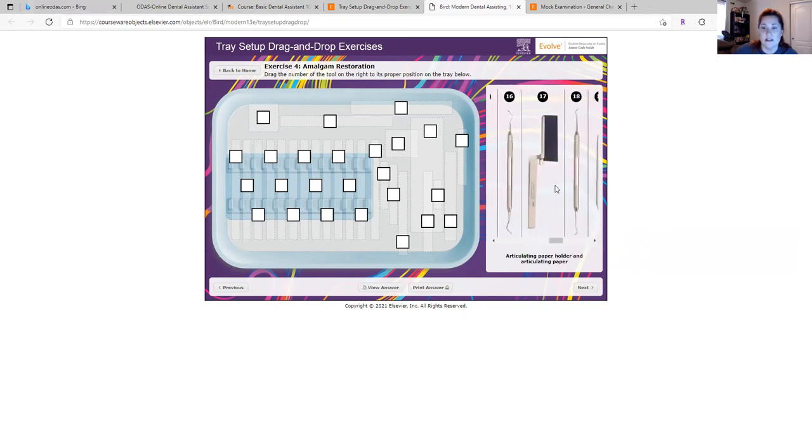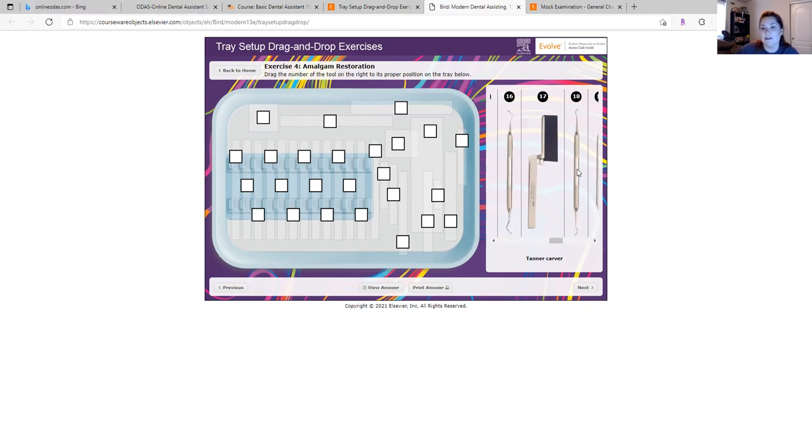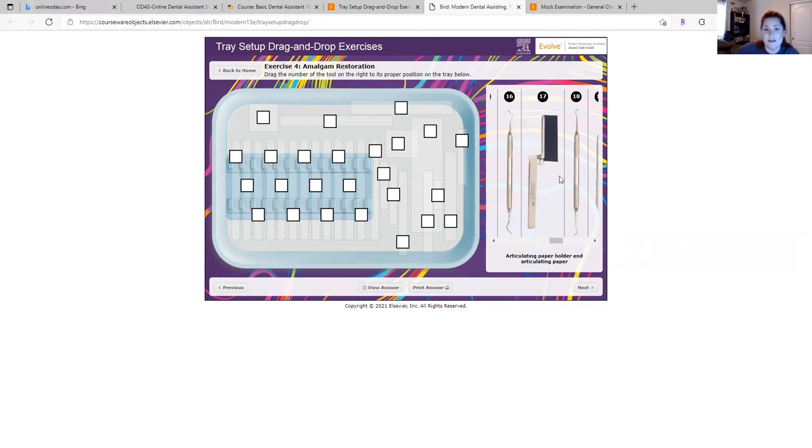This is most importantly what you'll need to know as a dental assistant - your instruments. And of course your teeth numbers. There's a lot to know as a dental assistant, but in school I didn't have anything interactive like this. So I think this is fantastic.